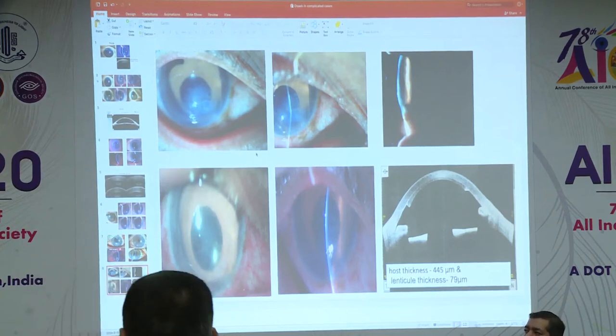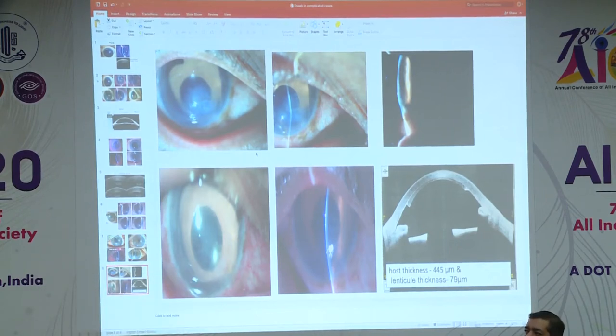Yes, we then looked at it. In the cornea, there was an oblique scar at the 4 o'clock area. And I could somehow avoid it and actually strip the Descemet's off that. He was an auto rickshaw driver, and he just came to us saying that he had had some injury. And that's all. I mean, no suturing, nothing. But I could find a faint scar over there.